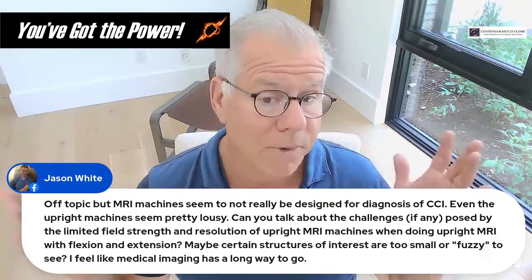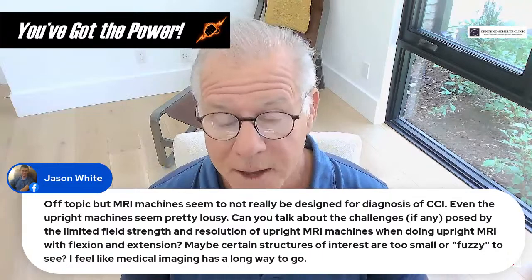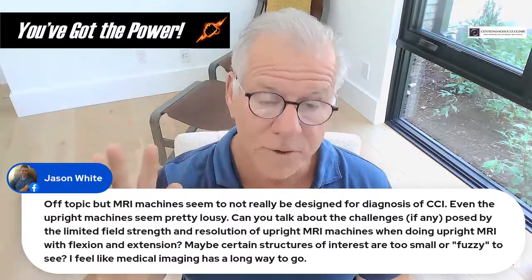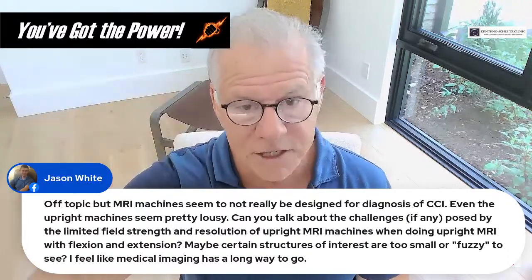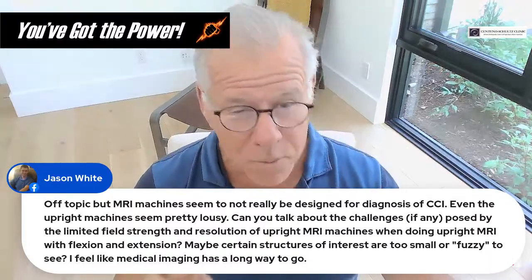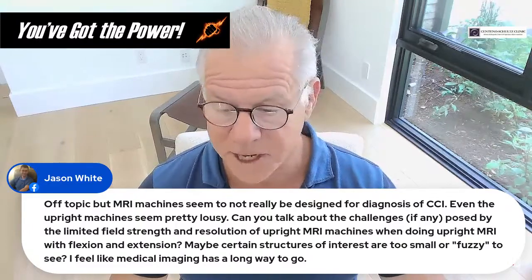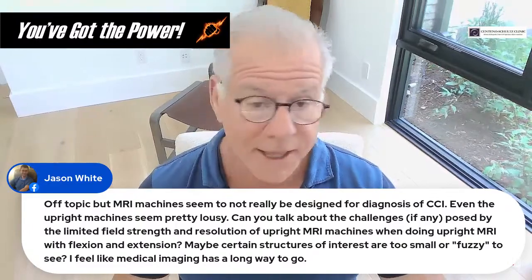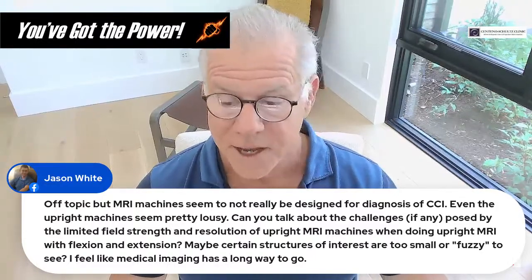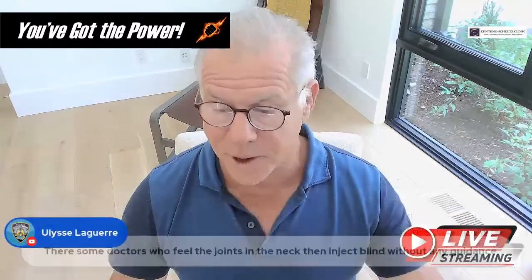And I would agree, all of these things have a way to go. I suspect that what we'll see in the next 10 years is not only some higher field strength magnets for open units, but also the addition of AI algorithms that are probably able to get more data for a better picture and clean up some of those artifacts that we see in the upright MRIs. But like anything else, the newest, latest, greatest machines are probably going to be the most expensive. And we'll see another 10 or 20 years while the older machines wind their way through their life cycle.